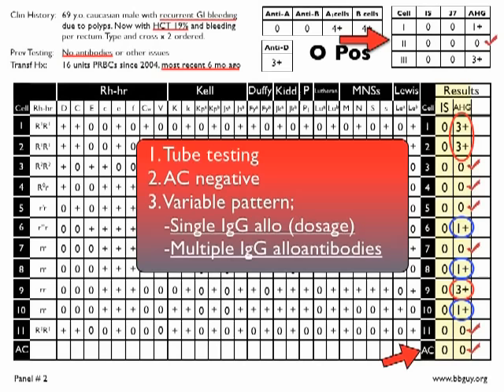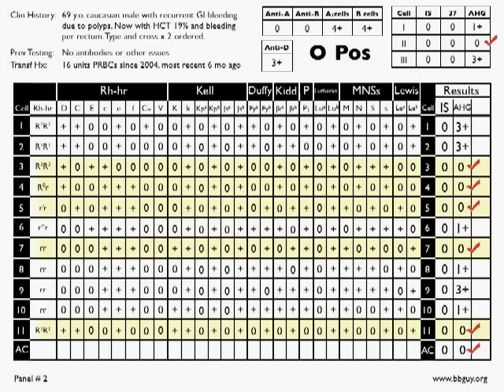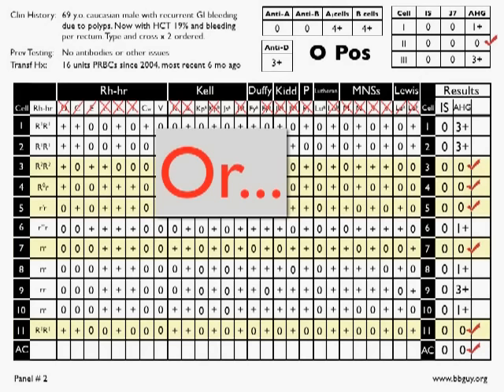So with that being said, I hope that you noticed all that and you went through and you started to look at the negatives and you did your crossouts and you had something that looks like this. So pause this for just a moment, take a look at it and make sure that what you have is similar to what you're seeing up here. Alternatively, as I said, if you wanted to do just the one and done philosophy, in other words, you do one slash for a double dose rule out and you don't do any more, then your crossouts would look like this. And again, it's fine either way.